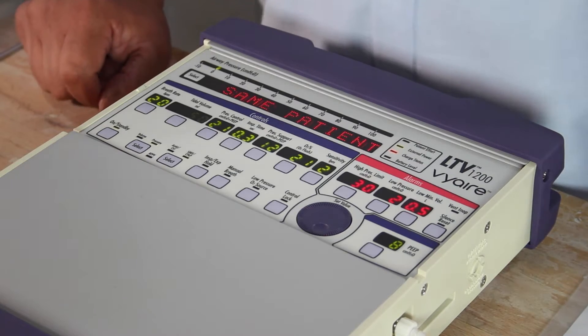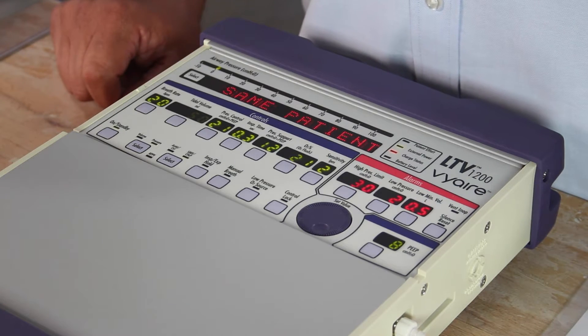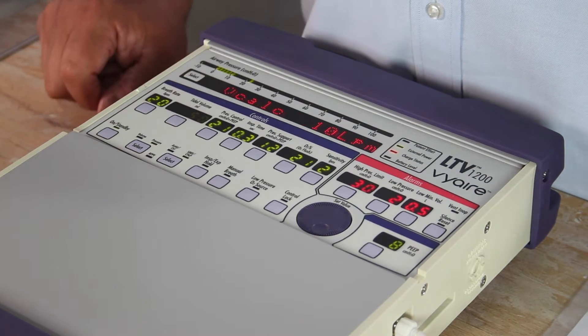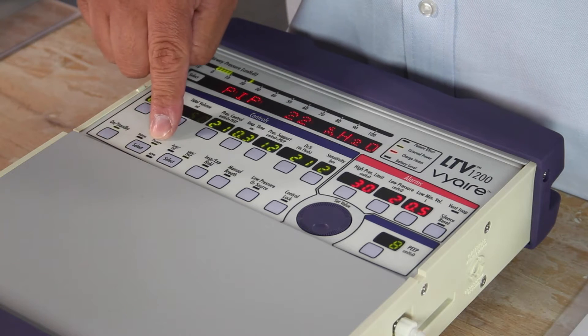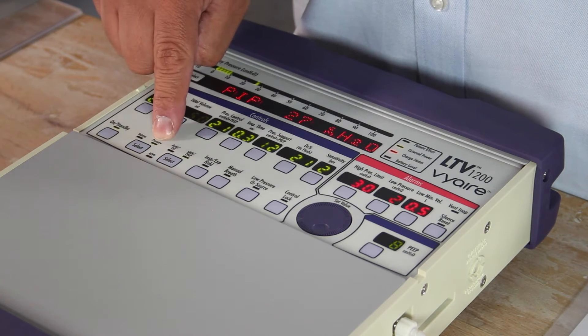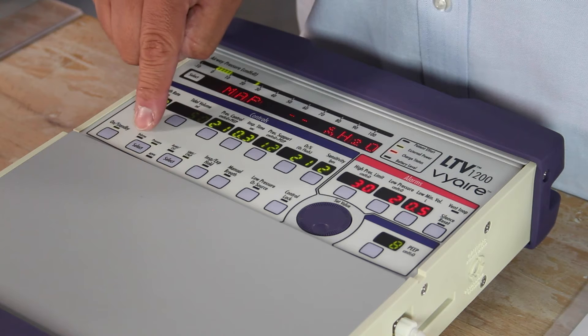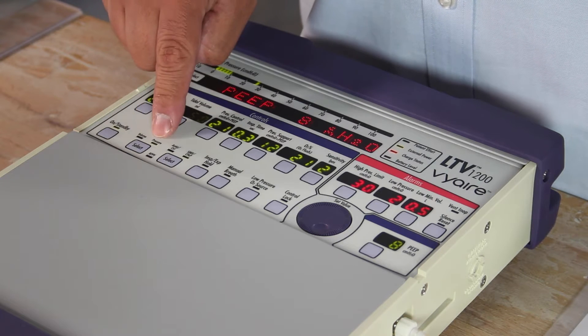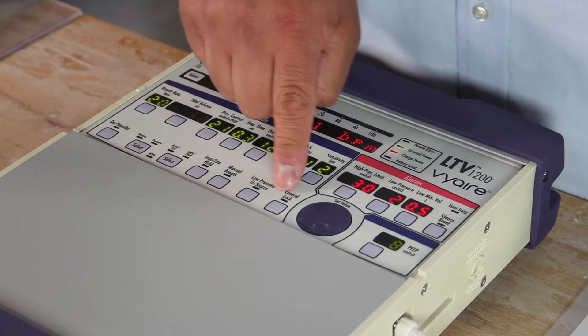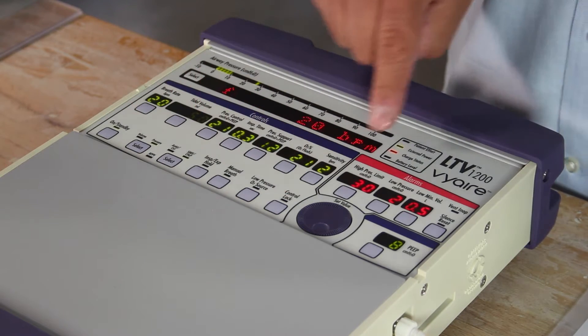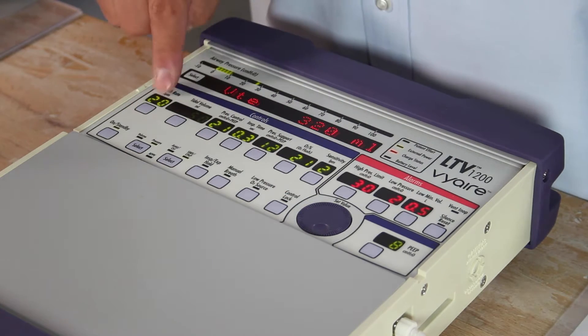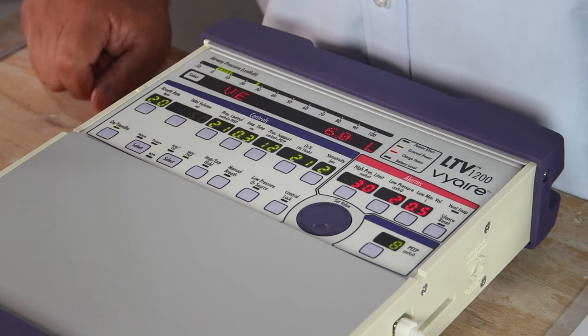The ventilator can be run in volume and pressure. To switch from one to the other, whichever mode is being highlighted is what we're currently using on the ventilator. Whatever's dimmed or dashes is not being used.